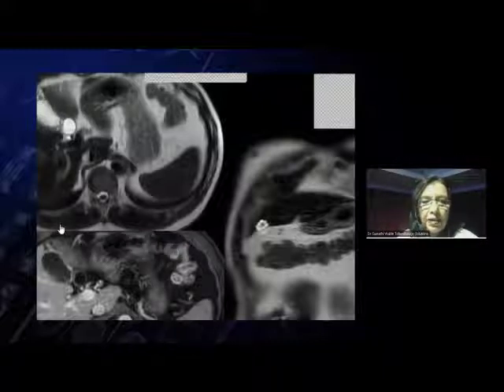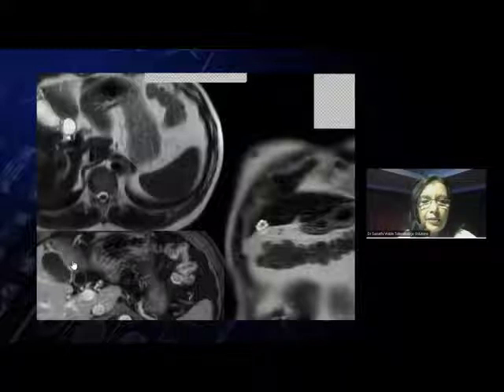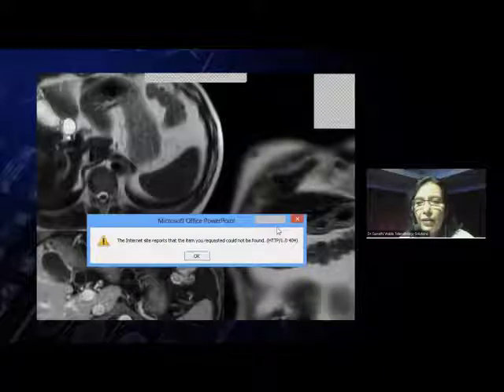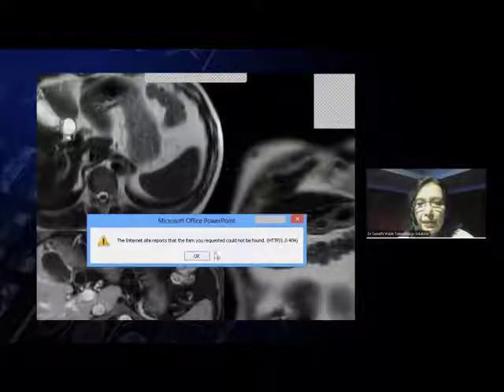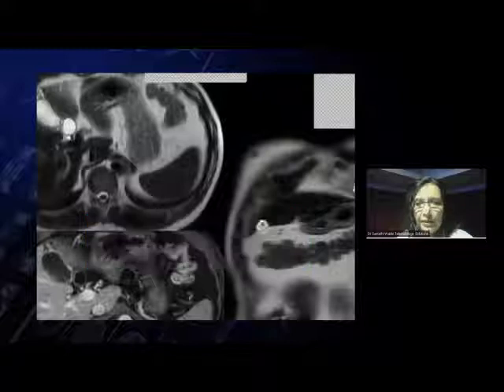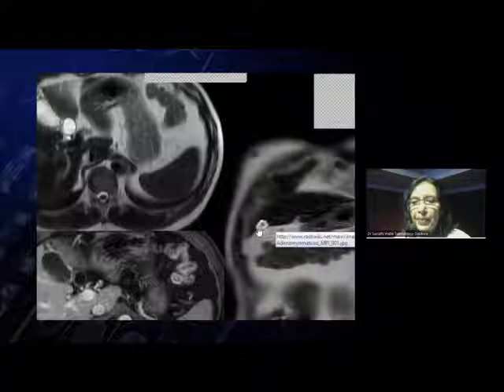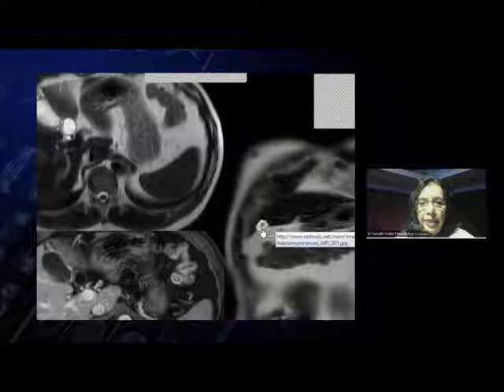On the contrast-enhanced images, the same areas do not enhance — they are actually dark. On the coronal images, you can see this segmented, circumferential appearance in the region of the gallbladder fundus.